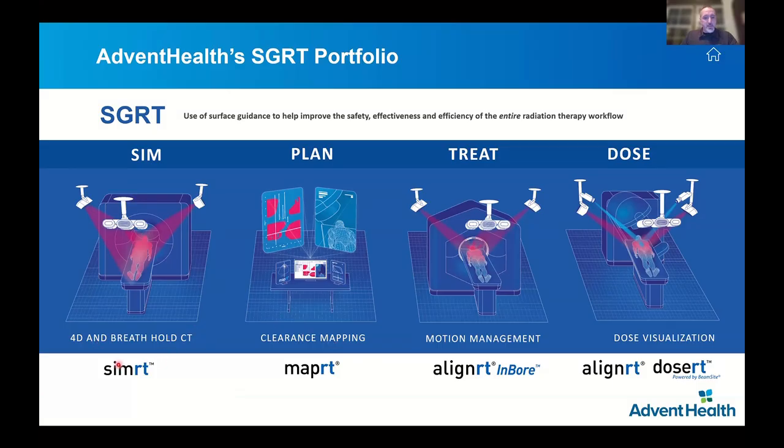We use SimRT, their product for 4D CT simulation and breath hold coaching at CT Sim. We use a MapRT product, which we'll talk about in this talk pretty extensively, for clearance mapping and non-coplanar planning, or what we call surface-guided planning in our institutions. We're using that to ensure that there are no collisions with our non-coplanar planning, and also optimizing the delivery of our treatment plans and making sure that they're most efficient before they reach the machine.